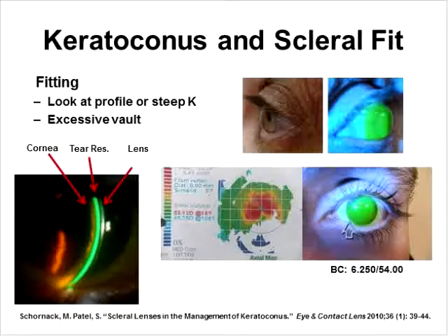The second peripheral curve vaults the limbal area with a total width of about 2 millimeters, and the third and fourth peripheral curve land on the sclera with a total width of about 4 millimeters. The standard diameter is about 18.2 millimeters.